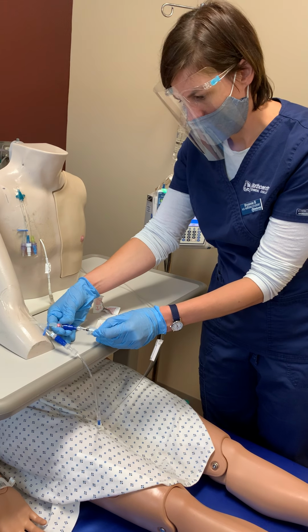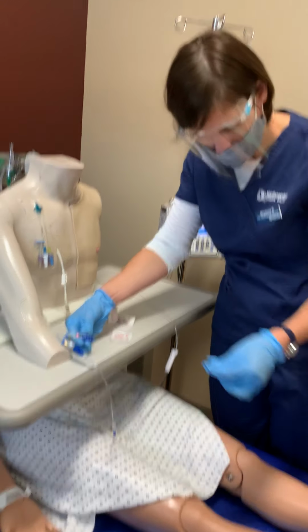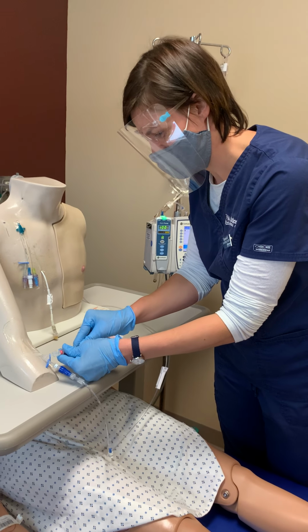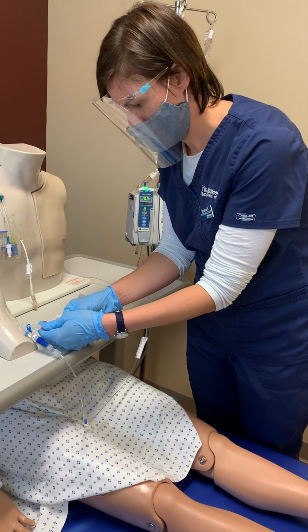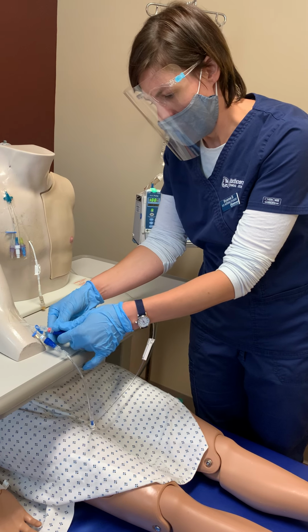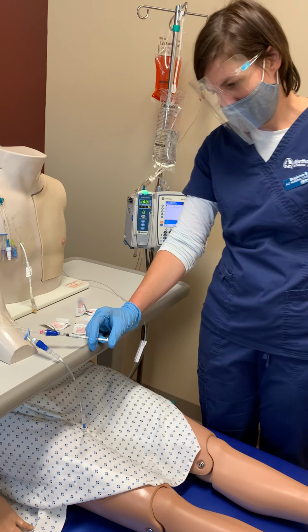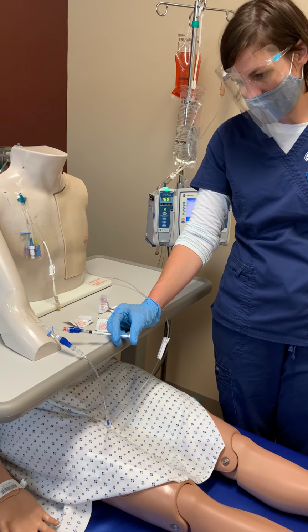Okay. Oops. Just kidding. What the heck? That didn't happen. Okay. I don't know why that's being ornery. Now, Betty Book said over 4 to 5 minutes for the morphine. So it is a tiny little syringe, so I'm going to be super cautious that I'm not pushing too fast.